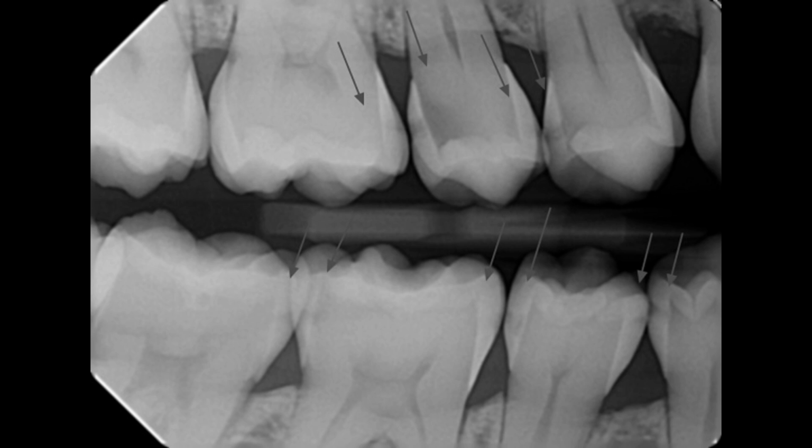If we were to have another view of this person where we opened up the contact between 30 and 31 in a molar view, we would probably be able to determine more accurately that there is decay there. That's one of the reasons why it is important that we take 4 bite wing x-rays so that we have another view that could reveal decay that was not seen due to the angulation or the overlap in the other x-ray.